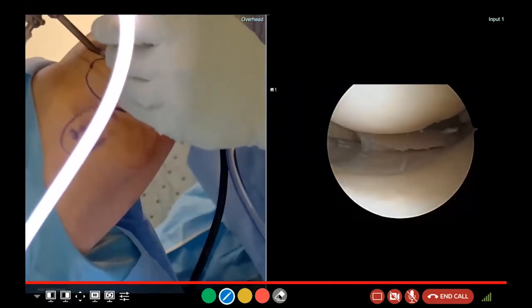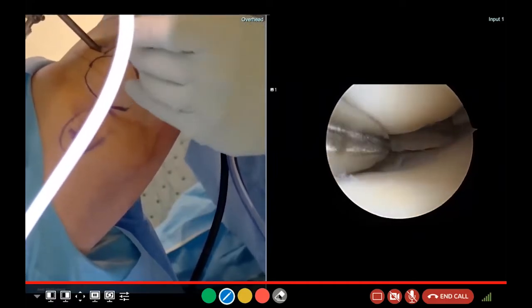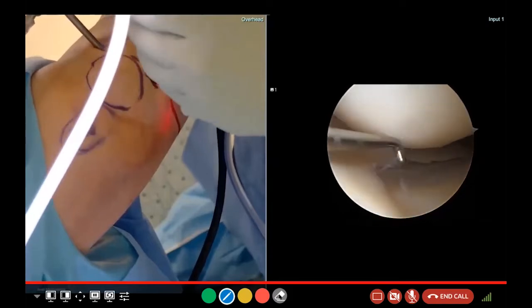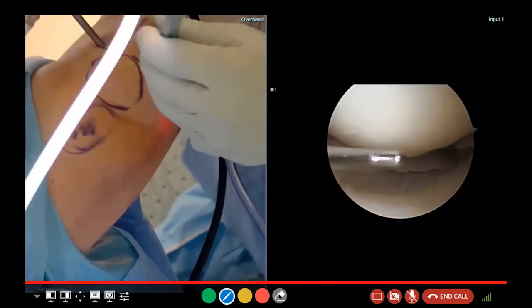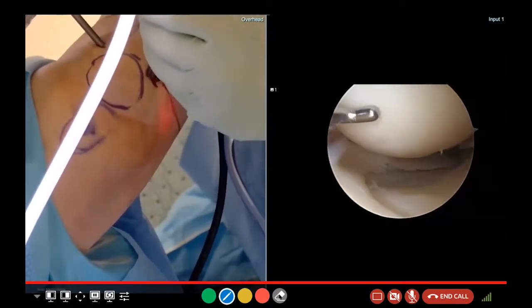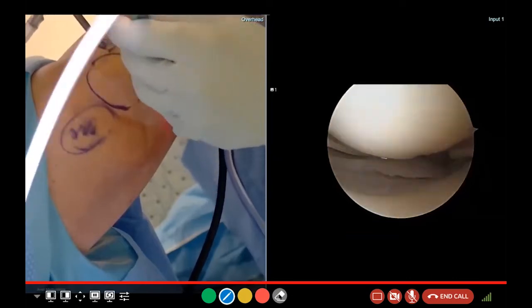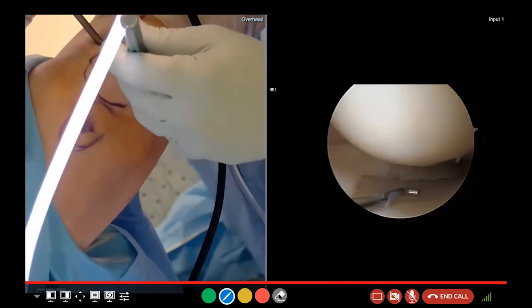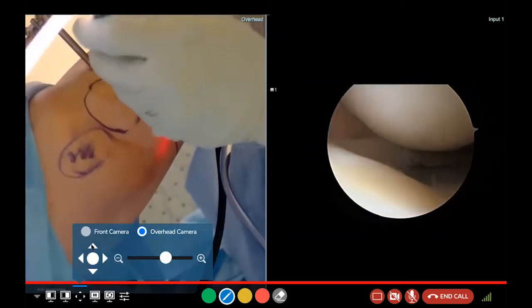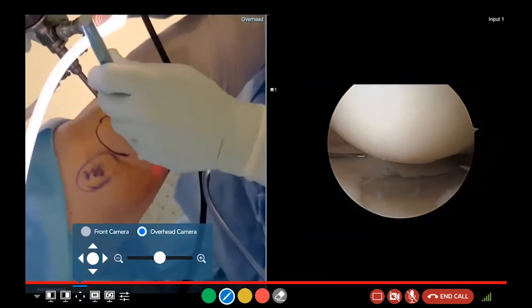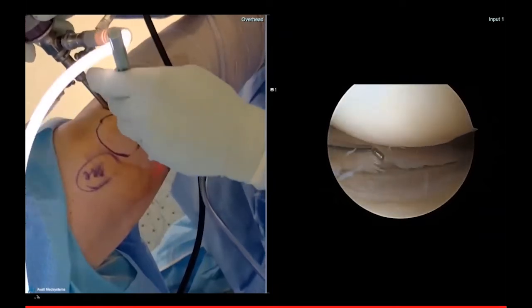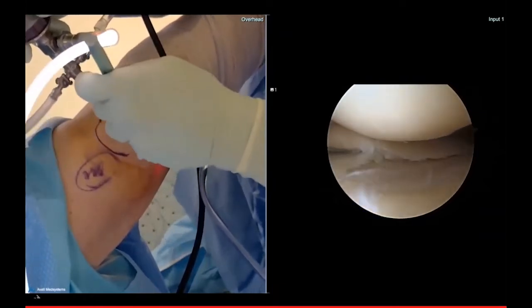It's really this meniscus here that we're after today. The meniscus is cartilage — that's a term that gets confused. There's articular cartilage, which we've already talked about. Outerbridge zero is normal cartilage, Outerbridge one is softening, Outerbridge two is a little bit deeper. Outerbridge four is when you can see bone — and I don't see any exposed bone in the joint yet. The meniscus should be one solid piece of tissue — kind of like a marshmallow. It sits in the joint and acts like a shock absorber. But you can see this is not one piece; this is torn in all kinds of bits. And that's what we saw on the MRI.